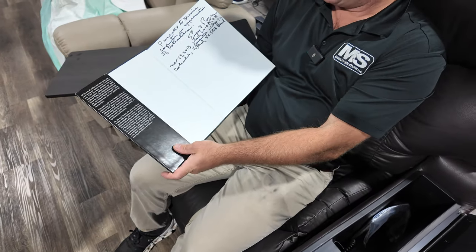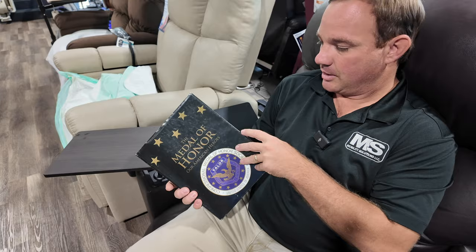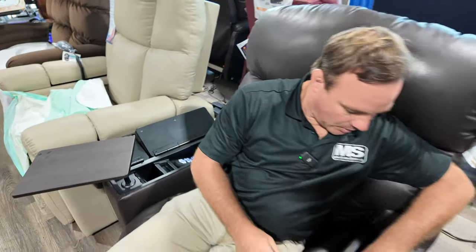You can store things in there like a book — this Medal of Honor book was actually given to us and signed by the guy who wrote it, so we're very thankful. Or you can put your Bible, medicine, or whatever you want in there.